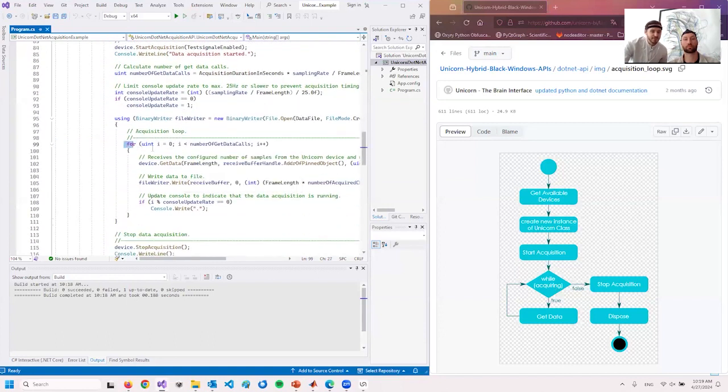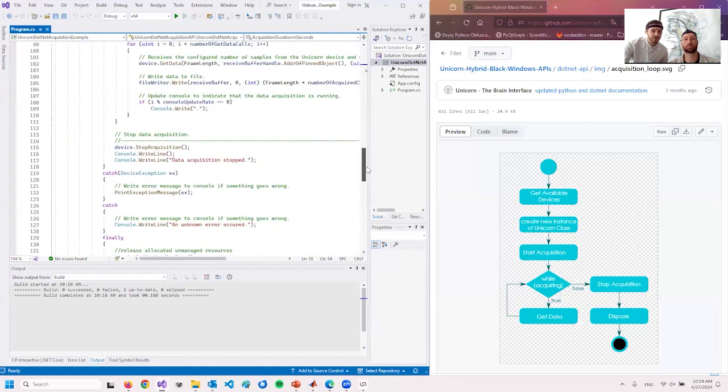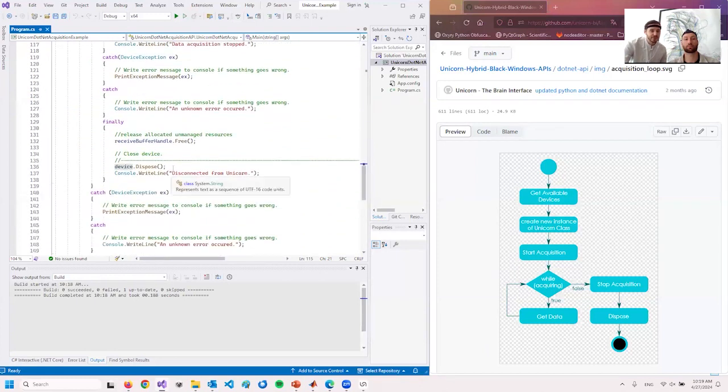This loop is a for loop, so we define how long we want to record data. In this case, we set 10 seconds. And in this loop, we're calling get data continuously. When we're done, we stop the data acquisition and close the device. So this short code example represents the image on the right-hand side.